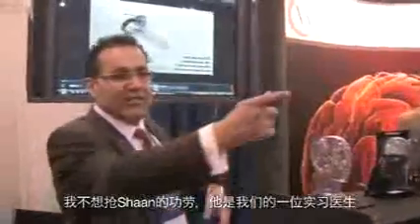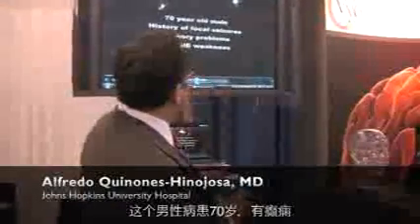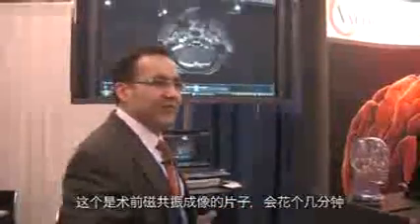All right. Anyway, I don't want to take credit for the work that Sean, one of our residents, has done with a couple of our postdocs, but this is the system that we have used. You guys already heard Dr. Rock. This is a 70-year-old man with history of seizures, memory loss, left upper extremity weakness. This is the preoperative MRI.